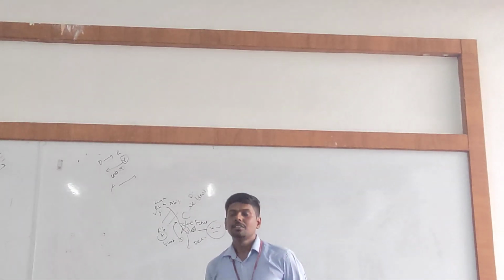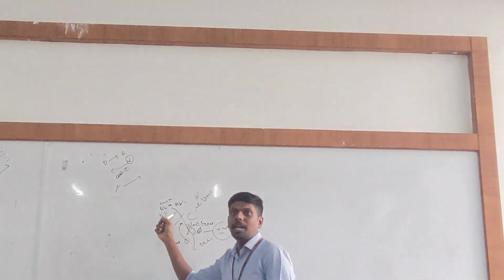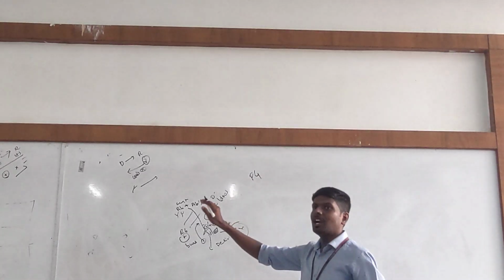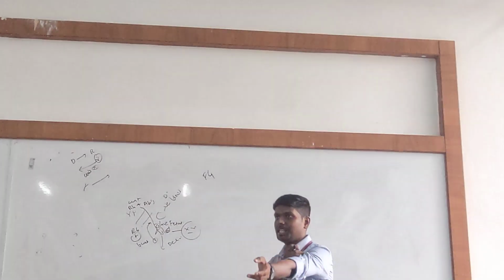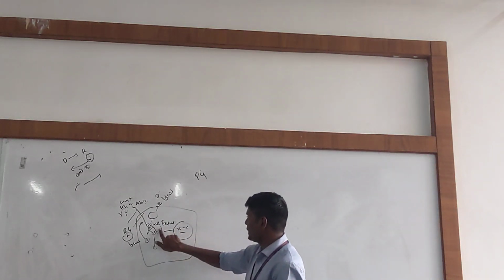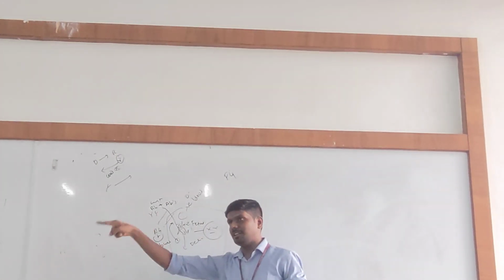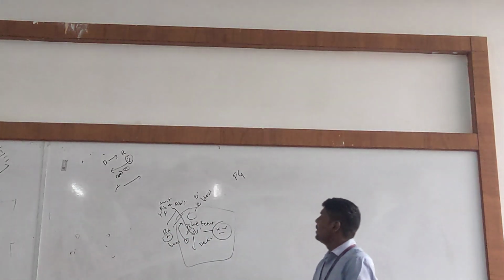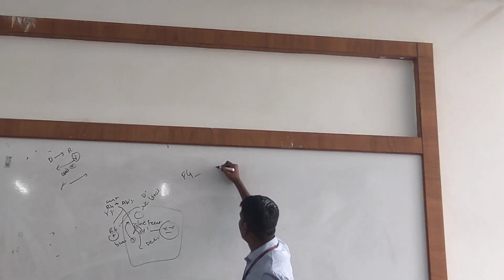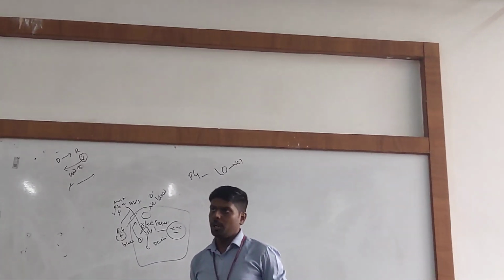Am I correct? Now, if you see her blood grouping, in the normal forward grouping, what is the result of her group? Let us see. This is the mother case. First pregnancy mother. She is a negative mother, but with a positive fetal delivery. Once you do forward grouping, the results look like this. The mother looks like an O negative mother.